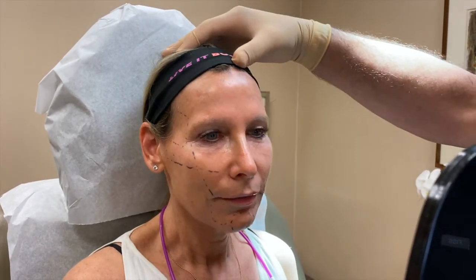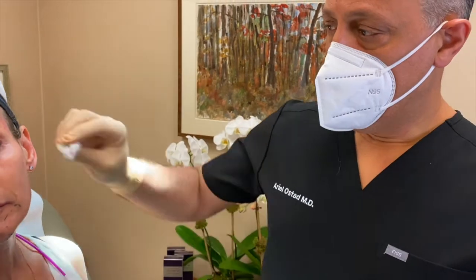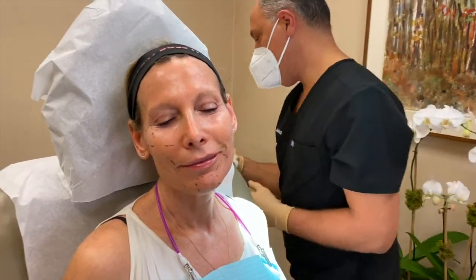And one of the things I'm really happy with, you barely see needle marks. You're going to see just a couple of needle marks. This is the beauty of using cannulas. You can kind of see, I didn't have to go with multiple pinprick injections. She can literally put a little bit of makeup and go. If anything, she has a tiny little bit of, unfortunately, a little bit of bruise, and that's where I used the needle. And this is the point about how we want to minimize that. But it looks amazing. We're going to go ahead to the other side.